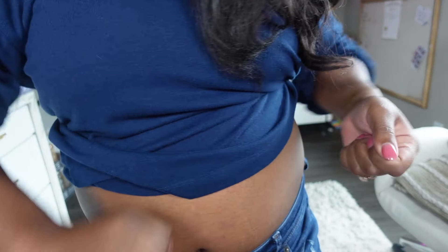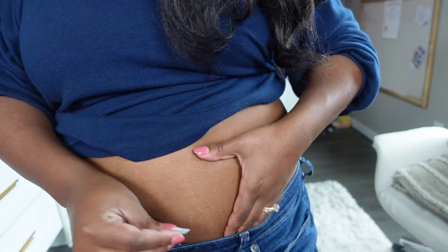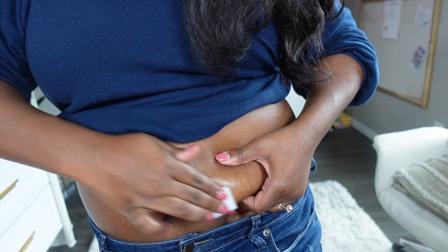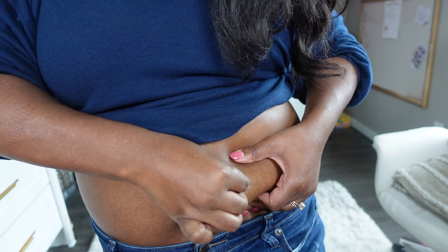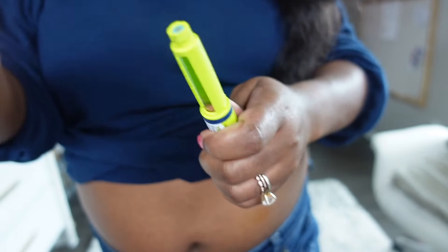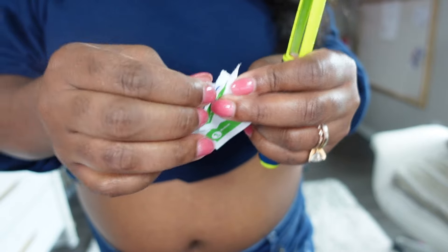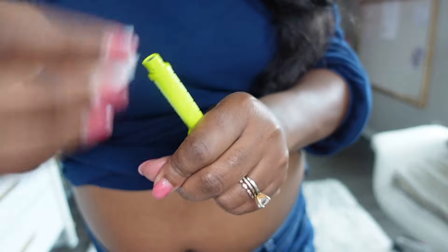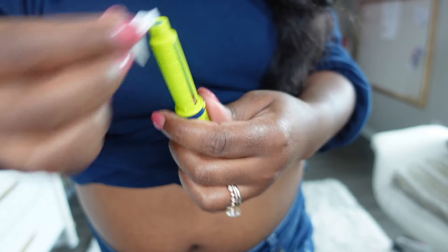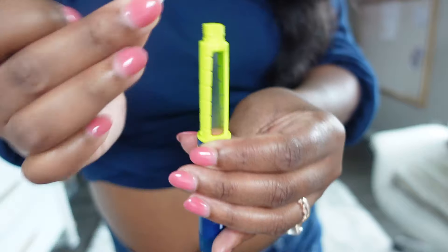So I'm going to take one of my sterile alcohol pads, open that up, and clean the area that I want to inject. I'll squeeze just so I know what that area is, and then I'm done with that. Then I take my insulin pen, uncap it, and use my other sterile alcohol swab to clean the top of the pen — because you never know where you've laid it down. Then I have my pen needle which goes on top of the pen.